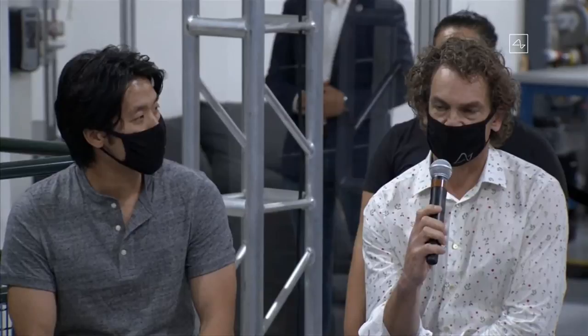So my background is in visual neuroscience, and one of the things I think has great potential for the Neuralink is to provide a visual prosthesis for people who have retinal injury or blindness through eye injury. You can essentially plug a camera directly into the visual cortex and stimulate with an enormous array of thousands or maybe tens of thousands of electrodes to recreate a visual image. And in time, perhaps you can use that same technology in people who haven't lost vision to produce some kind of heads-up display, something like Terminator.